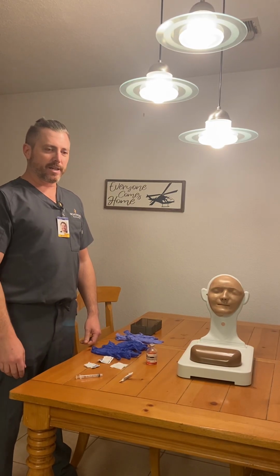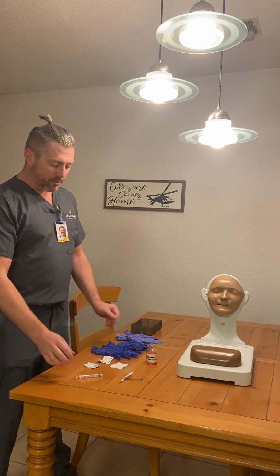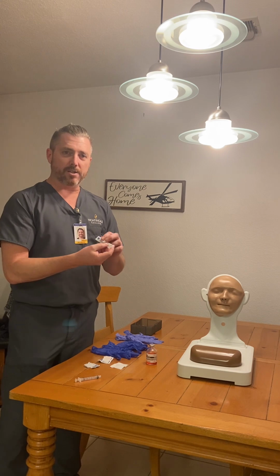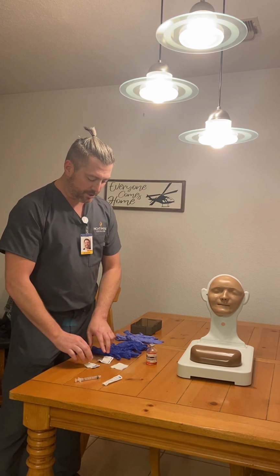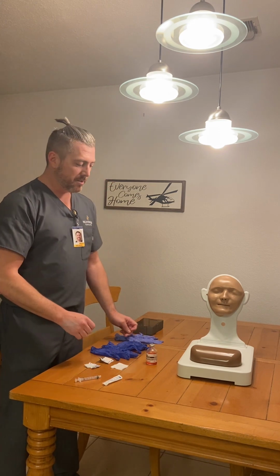Today I'll be performing the task of intramuscular medication administration. First we want to make sure we have the right supplies. I've got a 3 milliliter syringe, a hypodermic needle that's 22 gauge and 1 inch, gauze, 2 alcohol preps, 2 pairs of gloves, and a sharps container. Gloves just in case the other one rips.